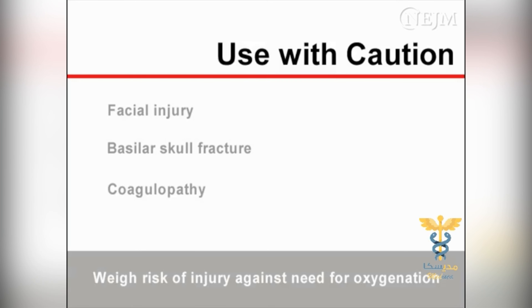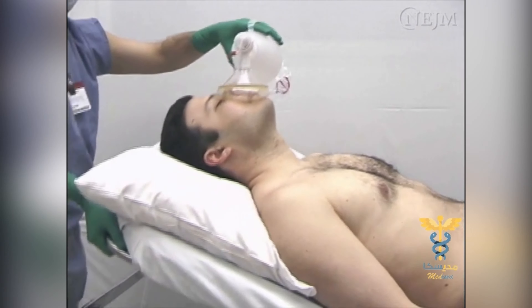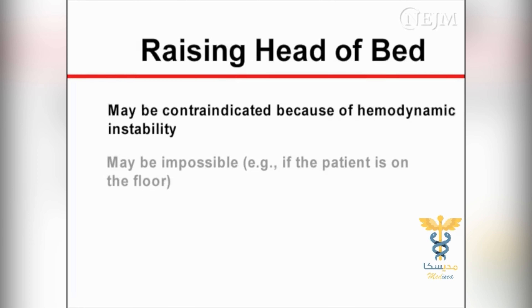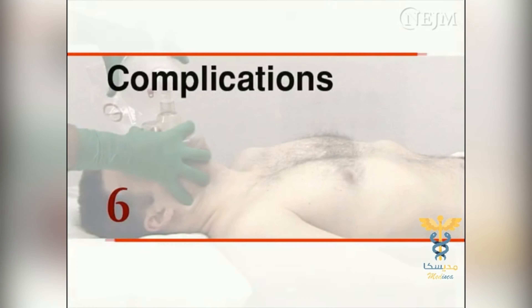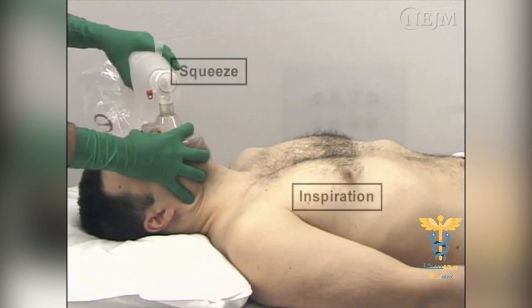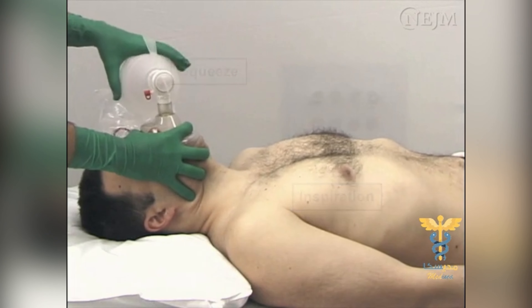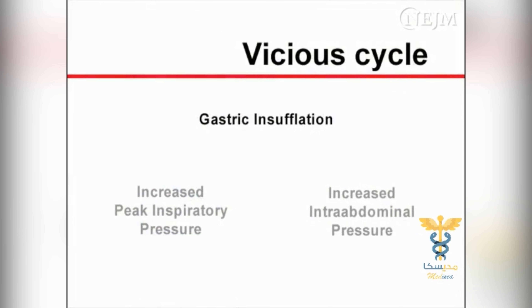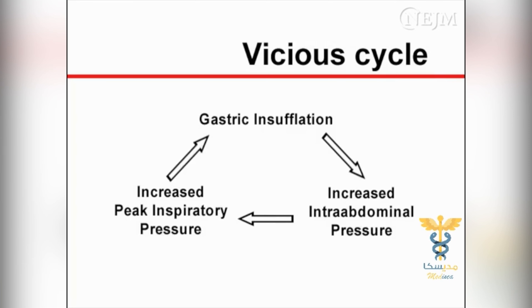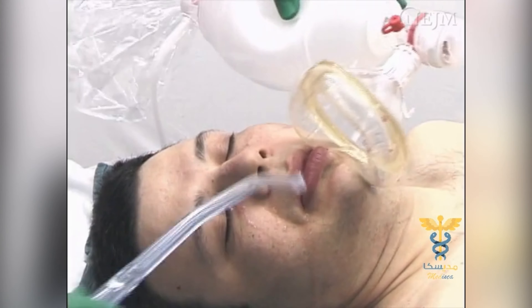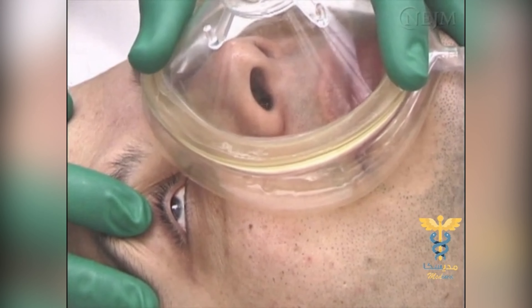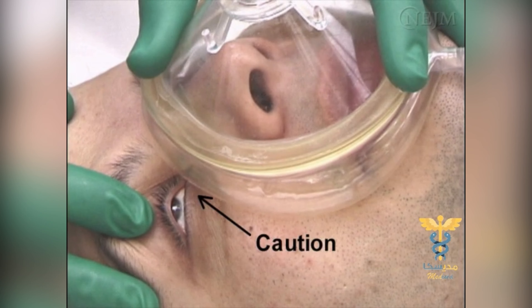Occasionally, it is difficult or impossible to provide ventilation unless an oral or nasal airway is inserted. These devices are most helpful when the cough and gag reflexes are absent. Insertion in patients with intact reflexes may precipitate coughing, vomiting, and laryngospasm. When used, the appropriate size device must be selected in order to avoid worsening of the airway obstruction. Too small an oral airway may push the tongue against the oropharynx. Too large an oral airway may push against the epiglottis and trigger laryngospasm. The correct size of an oral airway may be estimated by holding the airway next to the patient's mouth; the tip should reach the angle of the mandible and no further. An oropharyngeal airway can be inserted by depressing the tongue with a tongue blade and advancing the airway towards the base of the tongue. Alternatively, the airway can be inserted upside down and then rotated 180 degrees as it is being advanced posteriorly.